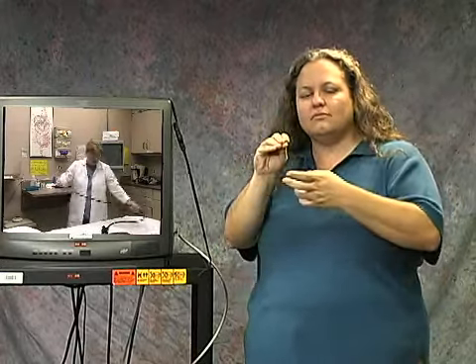Another type of test your doctor may send you to for various symptoms is called a colonoscopy. The colonoscopy is done with a video scope similar to the one for the upper, only it's obviously a little bit larger and longer. It's also articulated at the end. It's very soft and very flexible. There's a port on the scope to blow air into the colon. There's a suction port, and there's also a very bright light. There is a video chip on the end of the scope. So the physician is actually watching on a television monitor.